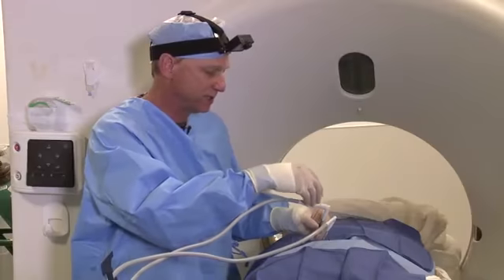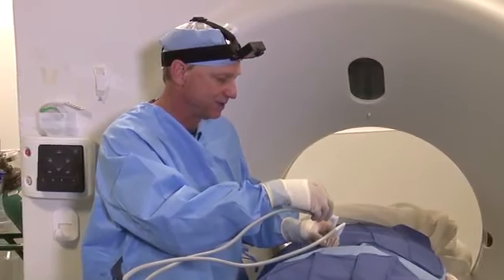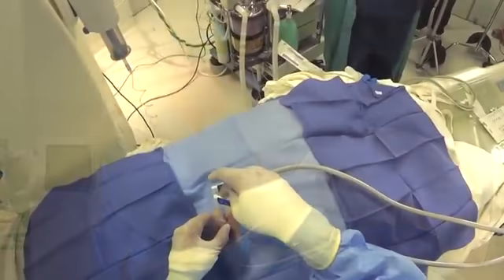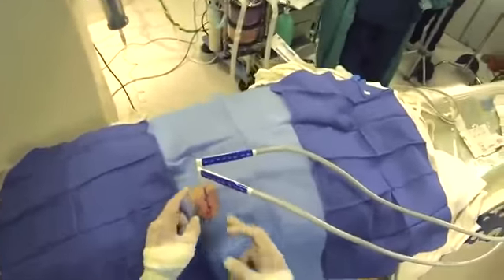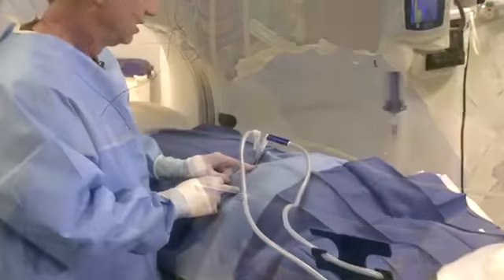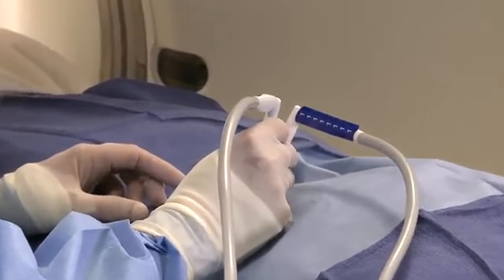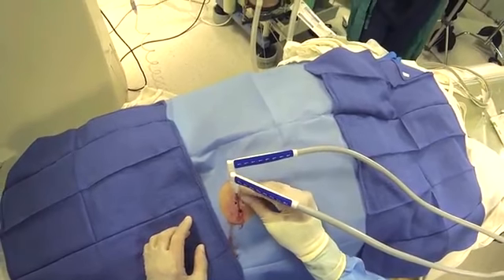So probe 2 is in place now. I'm going to just advance it to seat it at its depth. You kind of get the idea of depth from the probe that you've previously set. So now I believe that we've treated the inside of the lesion, the outside of the lesion, and the lower part of the lesion. I'll place a marker needle just roughly here again to check out the upper part of the lesion.